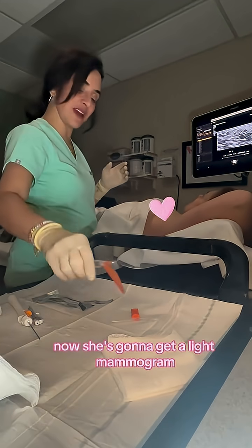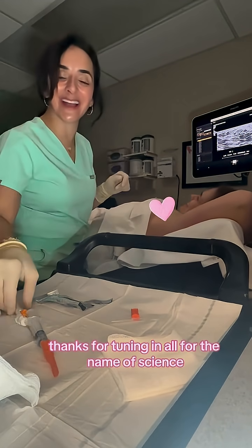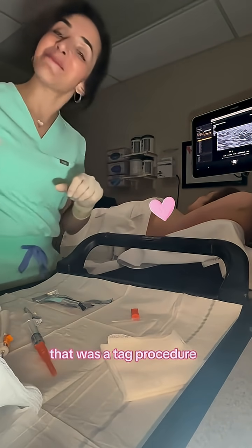And that's it. Now she's going to get a mammogram. Thanks for tuning in — all for the name of science. That was the tag procedure. Bye.